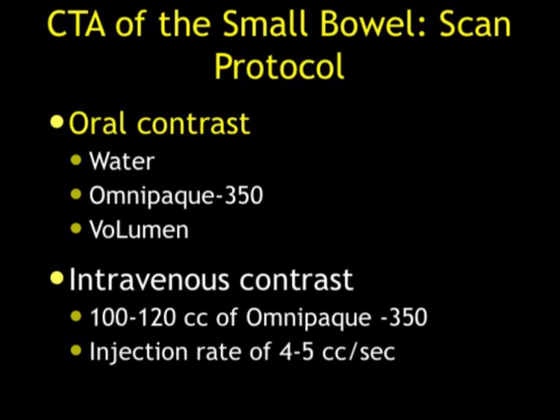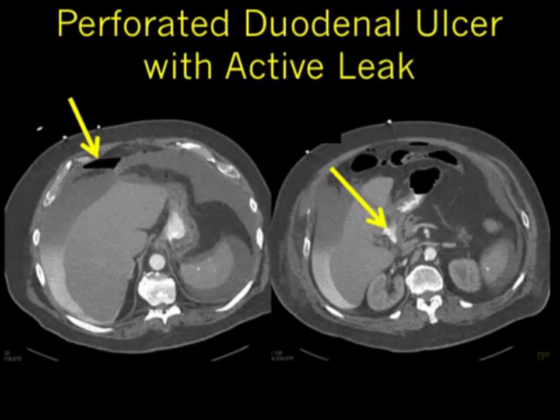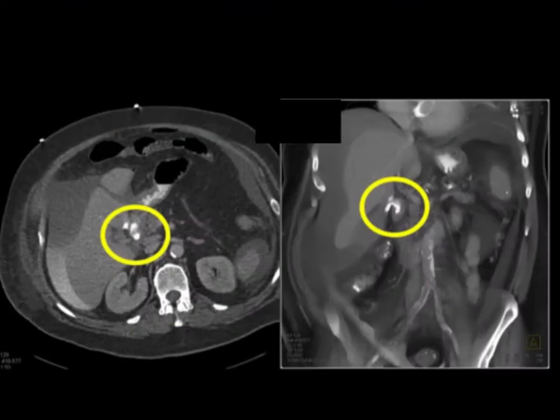On the topic of water versus positive contrast: if you're looking for perforation, you use positive contrast — we use oral Omnipaque. If you can't give IV contrast, we also use oral Omnipaque. In this case, you can see the patient has a perforation from the duodenum. You see the pneumoperitoneum very nicely. A very easy example of where positive contrast works oh so nicely.